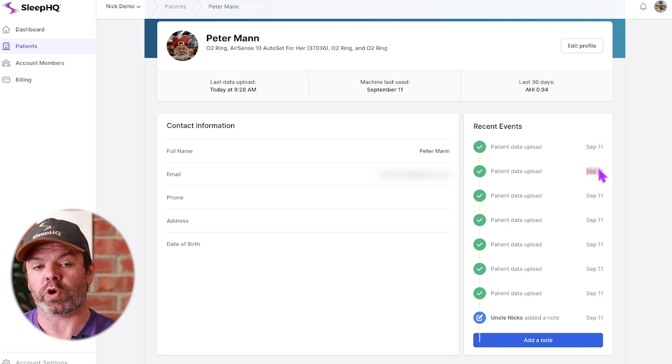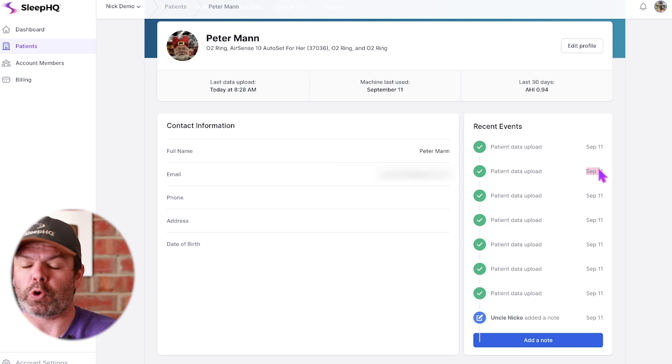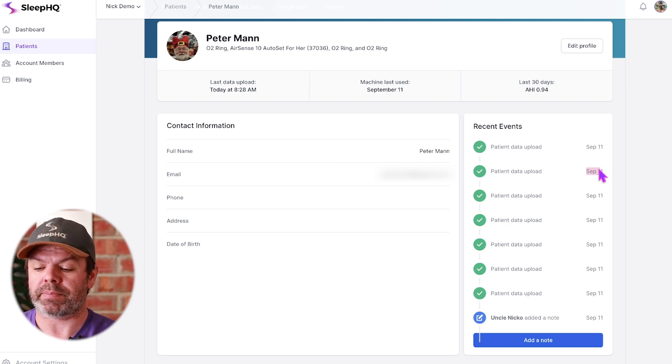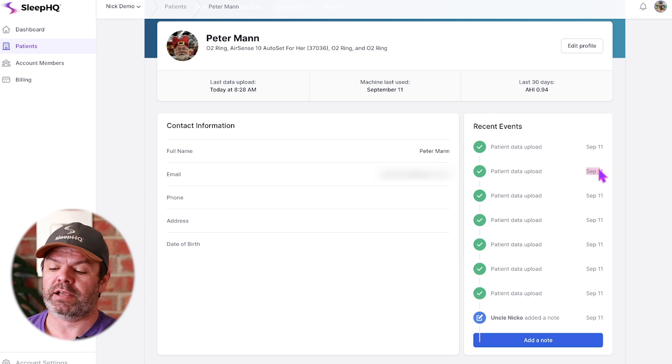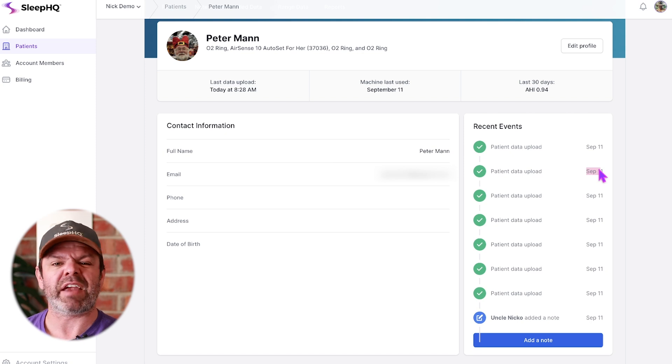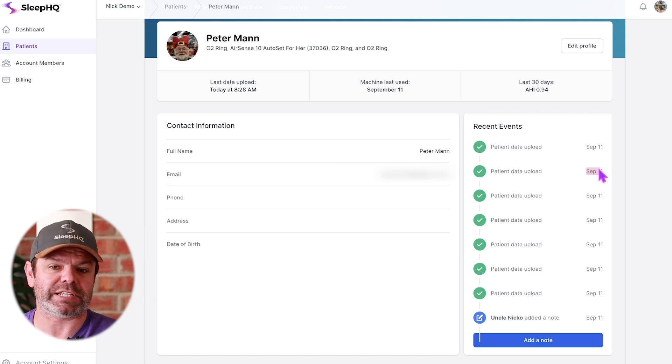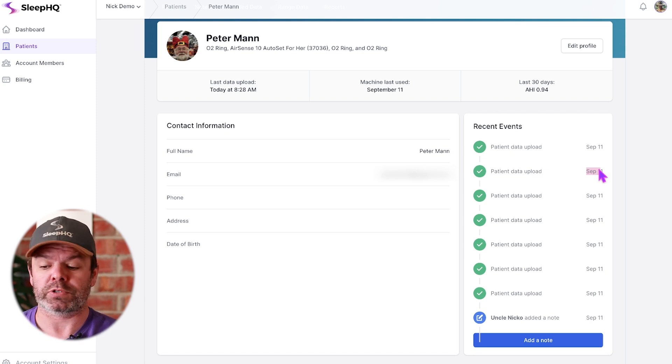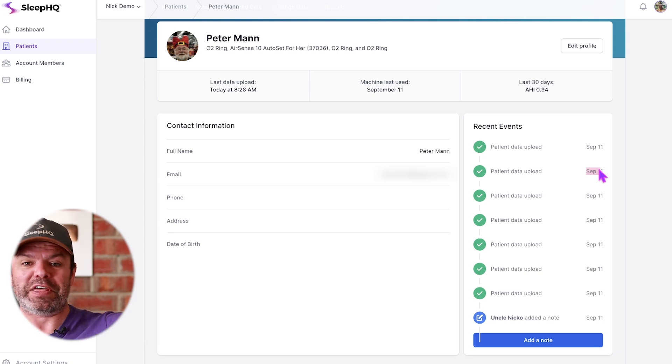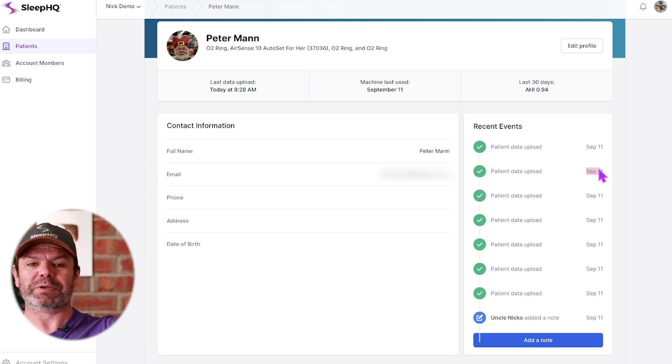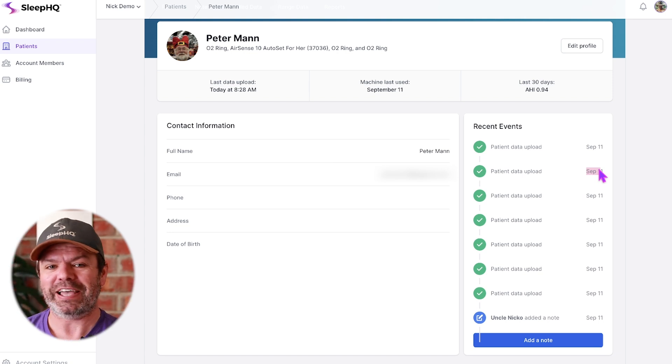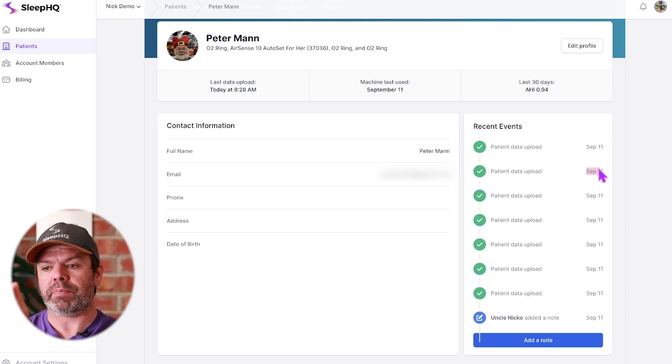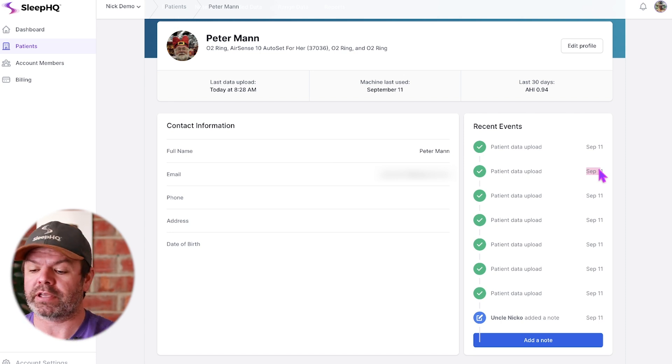You can see with Peter he's done a lot of uploads on September the 11th, and this is because Peter has what's called a Magic Uploader, which automatically uploads his CPAP data to Sleep HQ via his home Wi-Fi. It does this every 10 minutes, so it's pretty much CPAP data in real time.